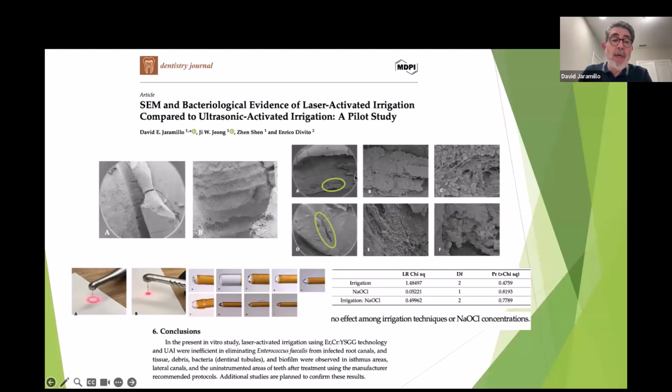This is biofilm that we contaminated the root canal with, with bacteria. This is in between the isthmus. This is a lateral canal full of pulp tissue. So the streaming produced by WaterLase inside the root canal system in the mesial root of lower molars, this streaming wasn't good enough to go into the dentin, into the isthmuses, debride the tissue, and debride the bacteria from those areas.